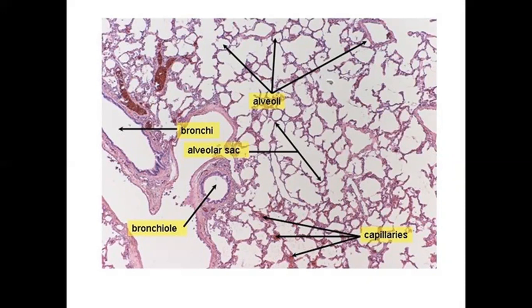الalveolar duct اللي هو يكون arises from the respiratory bronchiole and forms branches, and each of the alveolar ducts usually ends with a blind end composed of two or more small clusters of alveoli. وهذه الكلاستر هي نسميها sac. يعني هي تبدي عندنا duct، هذا duct عندنا هذا، بعدين ينتهي بblind end اللي هي 2 or 3. هذه هي كلياتها نسميها sac اللي يحوينا على more than one alveolus، بينما هي الوحدة الانديفيدوال هي نسميها الالفيولس. اوكي same.